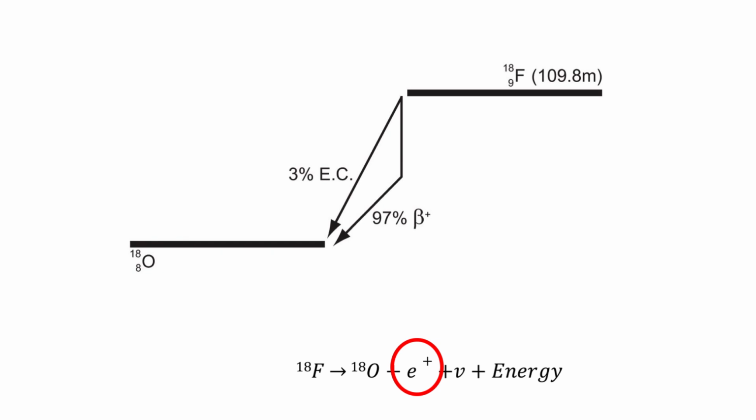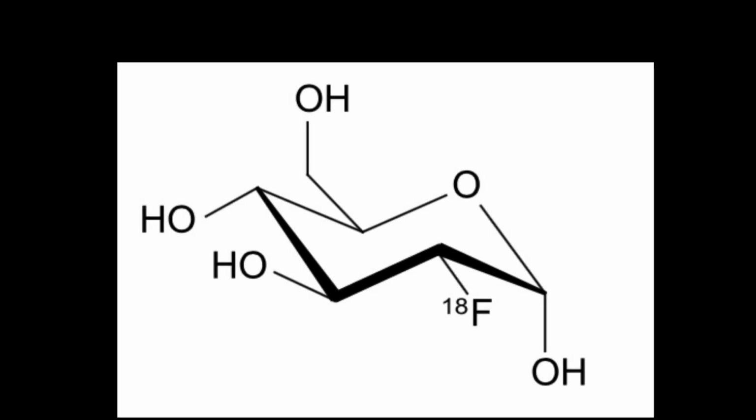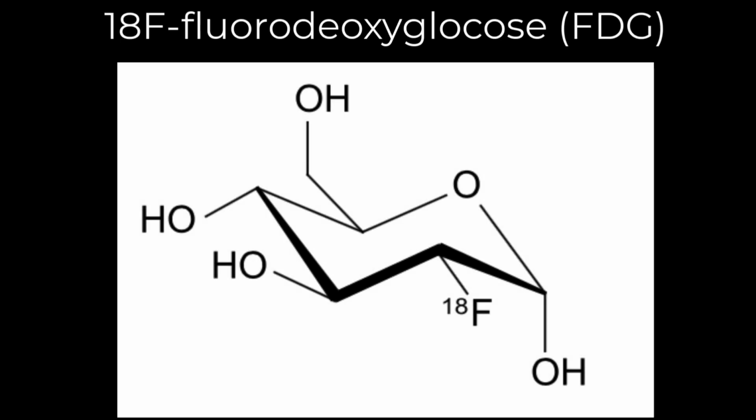Now, of course, to do something for oncologic imaging, you can't just inject raw F18 into the patient. It has to be conjugated to a molecule that does something of interest. And so let me go through the biochemistry of that for a minute. So we're talking here about F18 fluorodeoxyglucose. So that's a glucose analog that's taken up by tumor cells, these cells that are in anabolic metabolism. And that's an altered cell metabolism in cancer cells that's been known about since the 1930s.